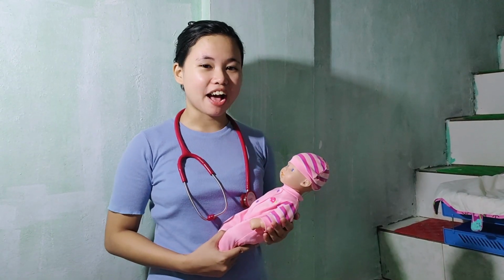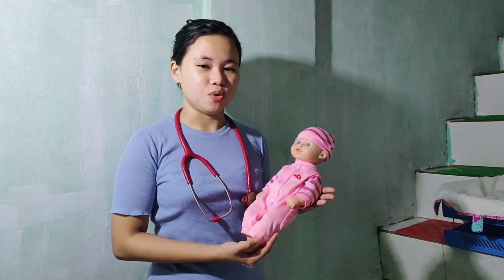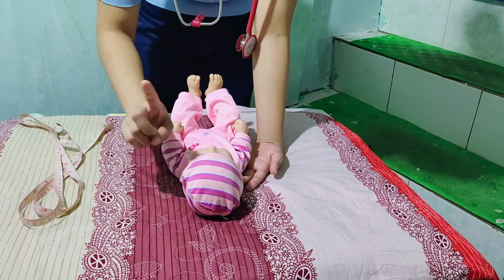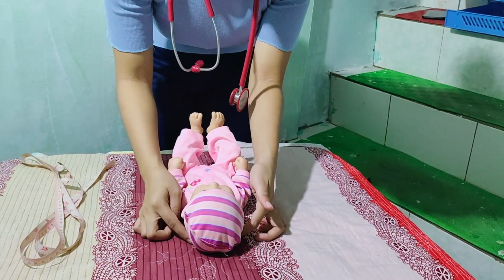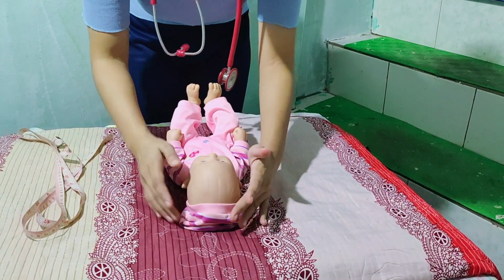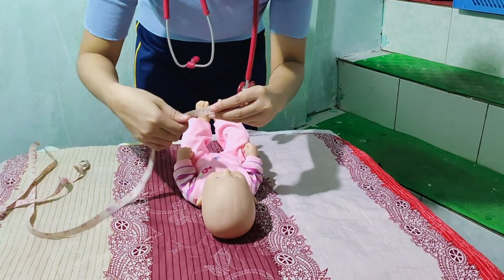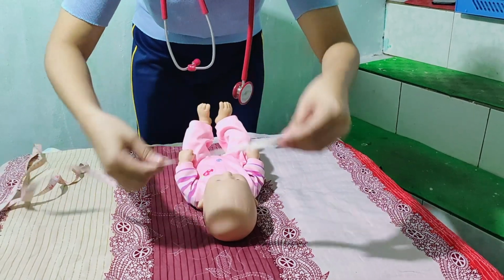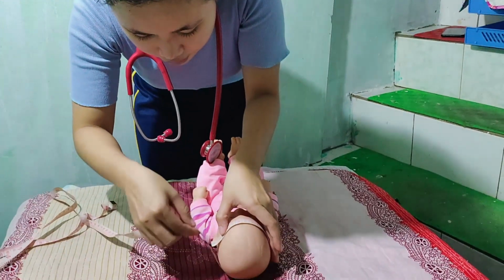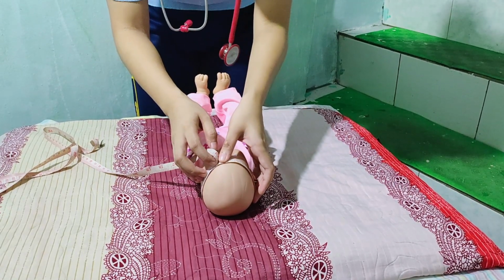Today, I have here a female newborn baby named Irfi. She is 2 weeks old, and now I will measure her head circumference. First, we need to remove the bonnet or the cap of the baby. And we will use a tape measure in centimeters. So we will do this one and this one. The head circumference of this baby is 33 centimeters.